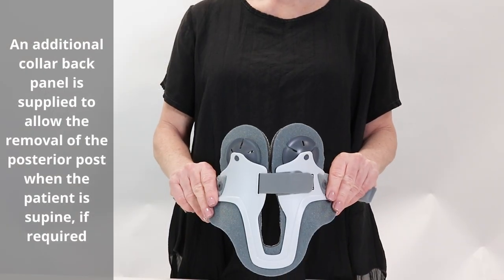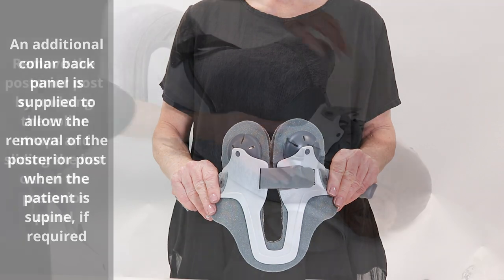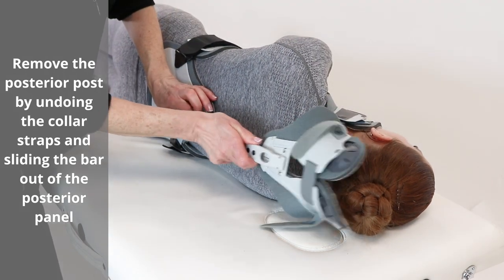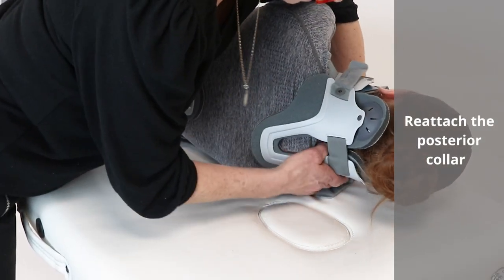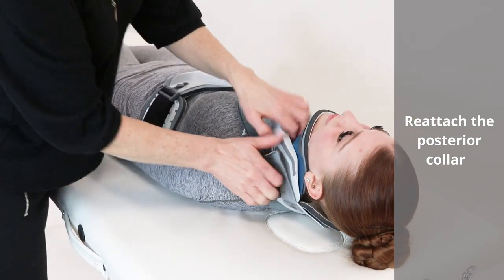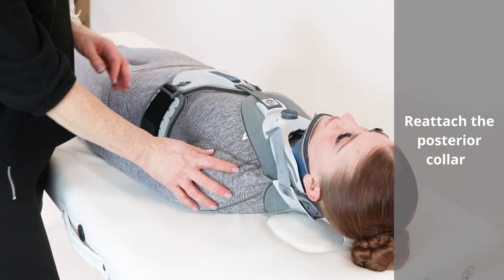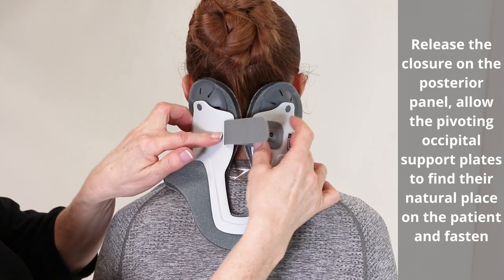An additional collar back panel is supplied to allow the removal of the posterior post when the patient is supine, if required. Remove the posterior post by undoing the collar straps and sliding the bar out of the posterior panel. Reattach the posterior collar. Release the closure on the posterior panel and allow the pivoting occipital support plates to find their natural place and fasten.